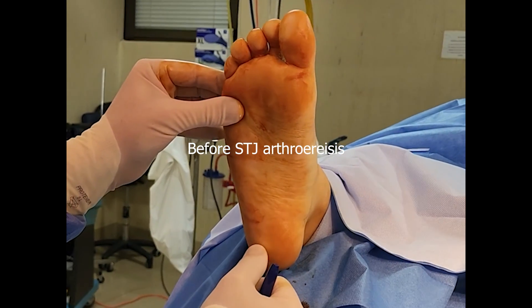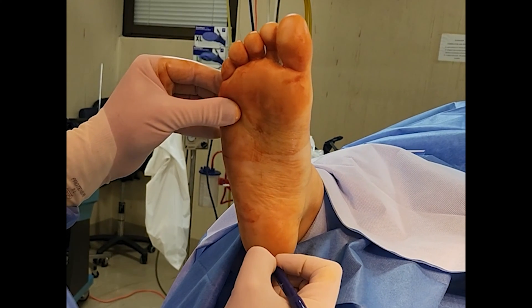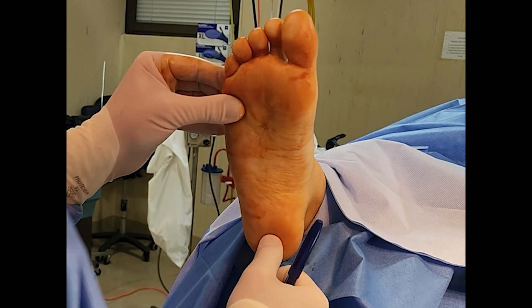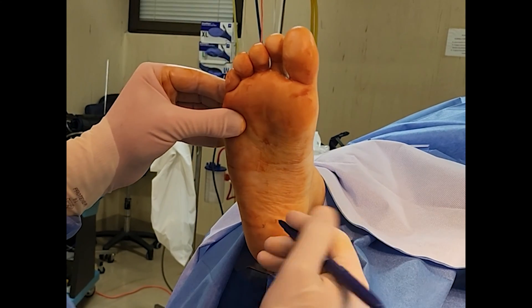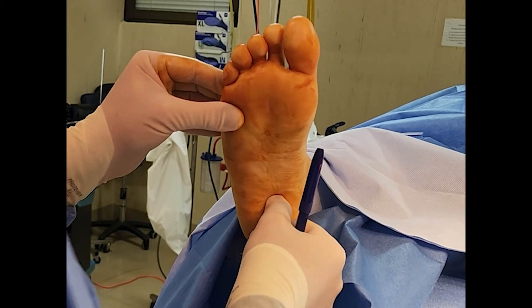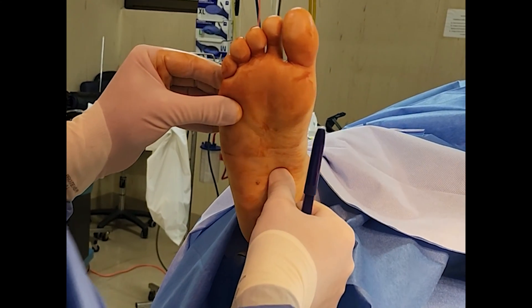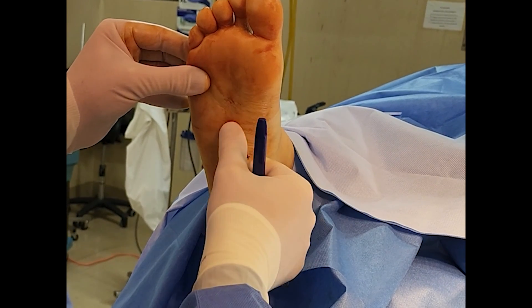Now let's examine the subtalar joint axis location using the palpation method. The forefoot was placed perpendicular to the tibia. This is not a test I perform often, so I am sure there were some inaccuracies in how I performed it.